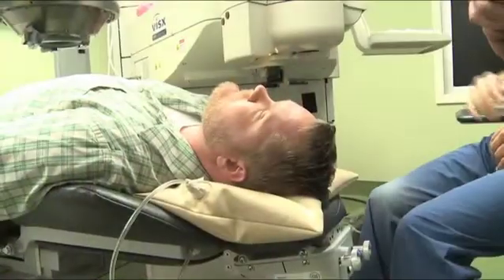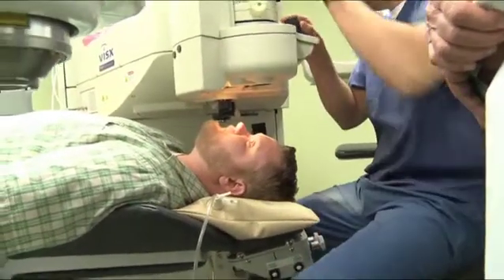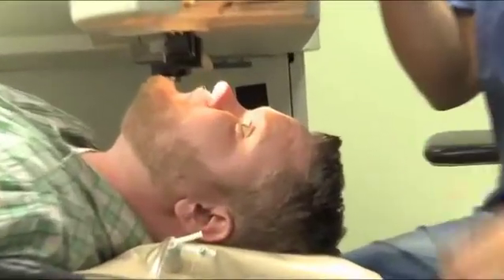There are a lot of pictures we take, such as pictures that give us a topographical representation of your cornea, which gives us the corneal thickness. It gives us any irregularities in your cornea that we need to look for. And it gives us an idea of where your prescription is. Now, there are certain irregularities that we do find in your cornea that may disqualify you from getting LASIK surgery.